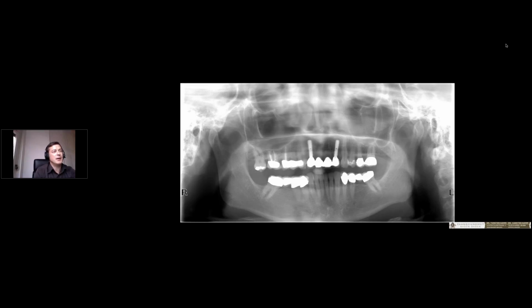And you see the gap between the implant and the teeth, 3 millimeters and more. In this case, you're using a 3.3 millimeter diameter implant, then you have a lot of space between the implant and the teeth, and then I will not lose so much bone, not on the vertical side, not on the buccal side, and this is the reason for us to get a lot of bone, to have stable situations after 5 or 10 or 20 years. So that's my final case.